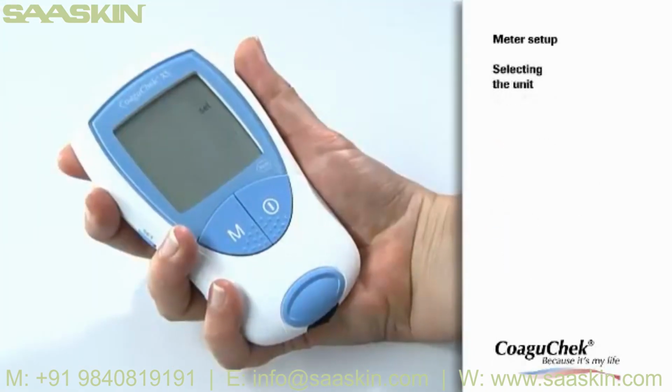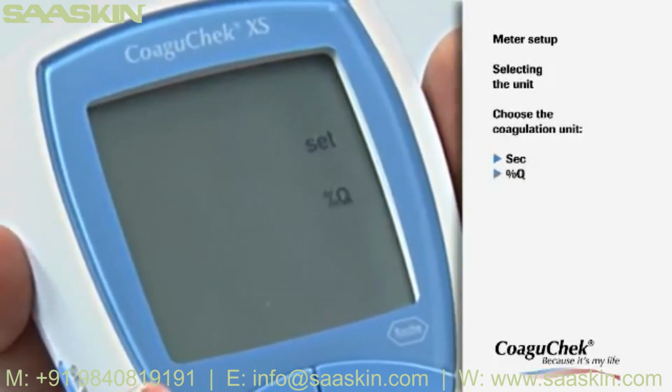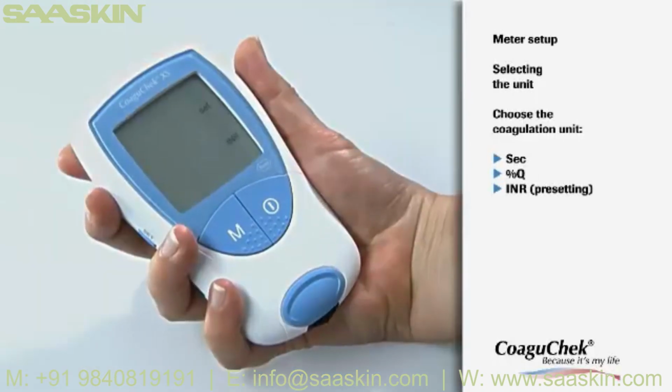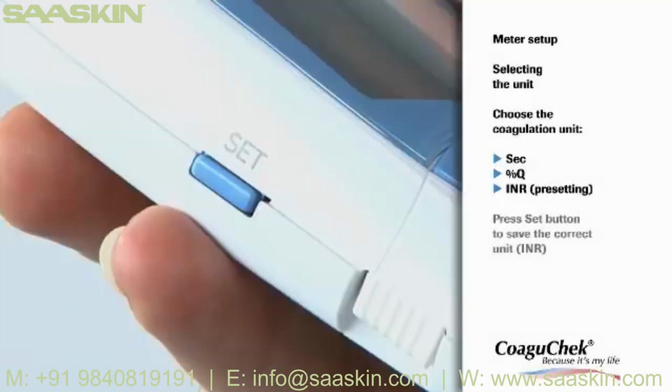It is important that you select the right coagulation unit. The CoaguChek XS meter offers you 3 options: the seconds, the quick value, and the INR value. Please ask your doctor if you are not sure what to select here. Press the M button to move through the 3 options and confirm your setting as above using the Set button.